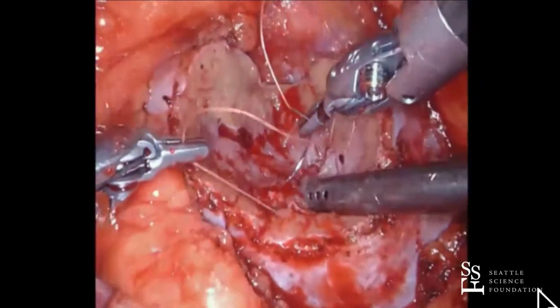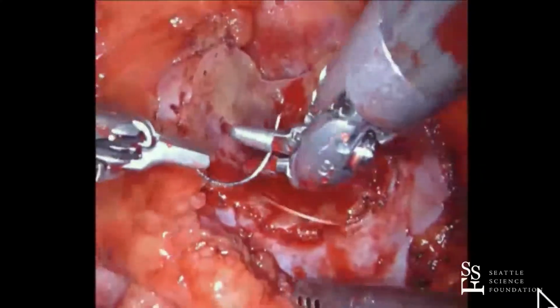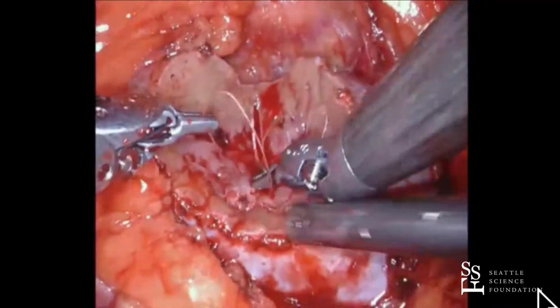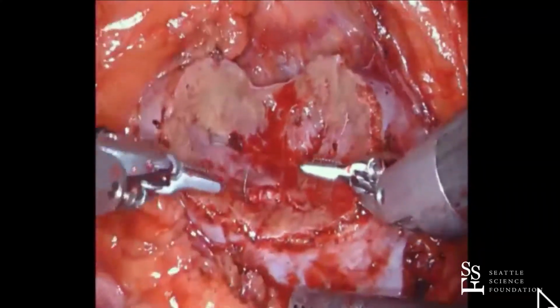Jim, is this a suture cut needle driver in your right hand? Yeah, it is. I was wrong. Good pickup. I don't think it's necessary. You can break. I don't like to break these small sutures, it's just a little more traumatic than I like.